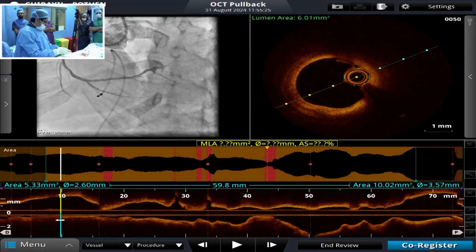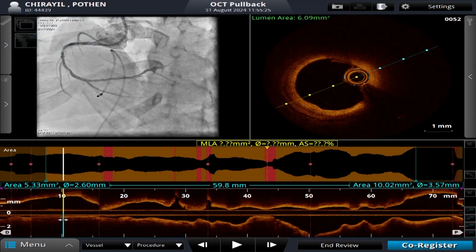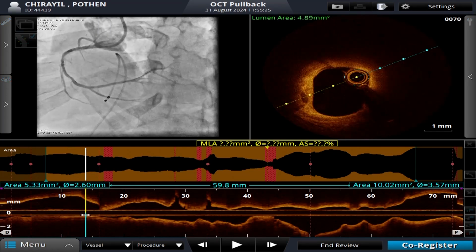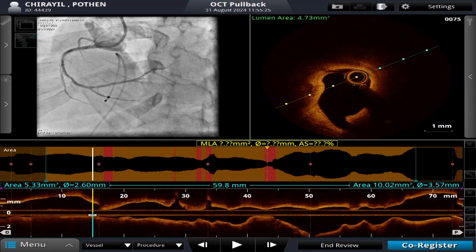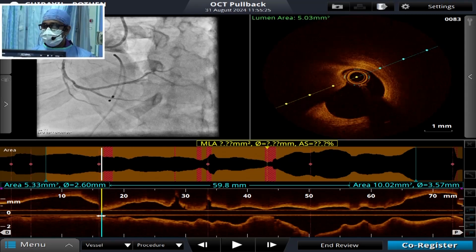In this view, these areas appear to be a decent landing zone wherein you are able to see 3 layers of the vessel almost 180 degrees. So this appears to be a reasonable landing zone. Now from there we come back and assess the lesion. Here it is more fibrotic with some specks of calcification. Again there's a nodular protrusion into the lumen, very close to the imaging catheter.